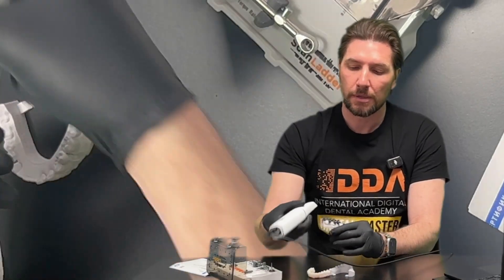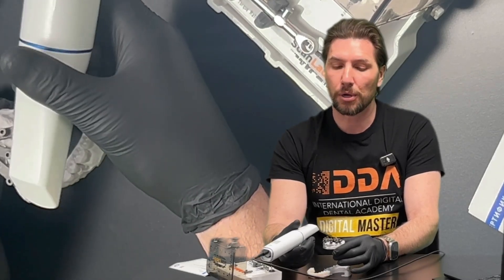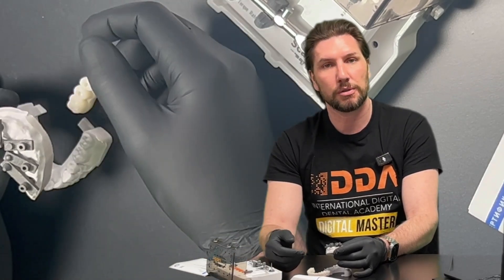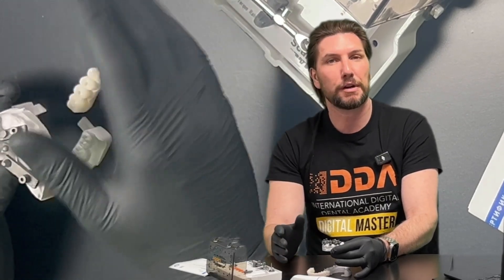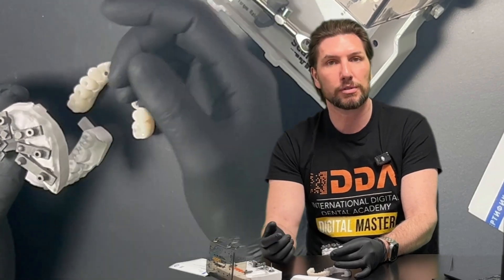The next tip is to make sure that when you're using the scanner, it doesn't knock any of the scan bodies and cause them to become loose. If you knock the scan bodies, you'll have to start that scanning session again because the scan bodies will change position. We have the benefit of the cylinders, so you could in theory remove the mis-scanned portion and re-scan that area, but I would recommend starting a fresh scan simply because it's so quick to re-scan when they're centrally positioned.